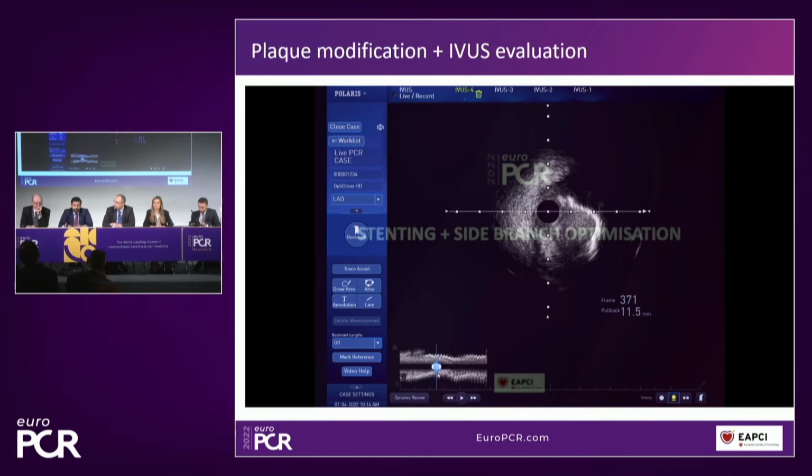Let me start again from Adrian. Well, I assume he's planning to implant a stent here, and therefore he needs to be sure that he has disrupted the plaque sufficiently that a stent is possible. And that means really that you haven't got an arc of 270 plus still, that the maximum arc is 180. You certainly don't want any more than that. So you want to see that there is lumen, you want to see there's free space. One has to recognize that when you expand a stent in the image that's there, that arc from 12 till 6, the stent will not expand very much in that area. That's just going to be fixed. And so all of your expansion is going to be between 6 and 11. That's the area of the vessel you can now dilate.